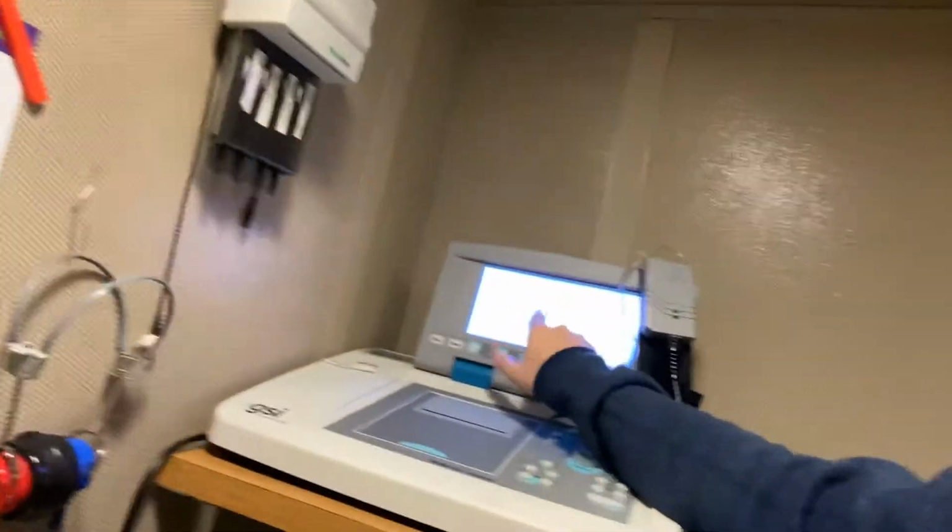So what will happen for a newborn hearing screening, the baby will do OAEs and maybe tympanometry. If we see a flat tymp, like the eardrum's not moving, and absent OAEs, we will generally assume on the baby it's because there's fluid in the middle ear space. If we see mobile tympanometry and absent OAEs, that's when we start to worry that maybe it is indeed a hearing loss. That baby we will refer for an auditory brainstem response and do the whole rigmarole.